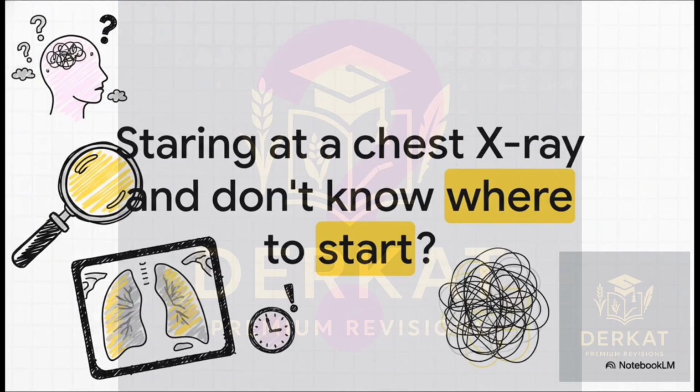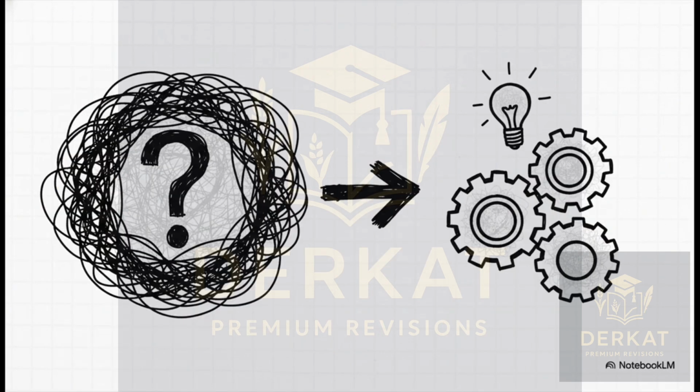Yeah, does this look familiar? That blank stare, the clock ticking down, and you're just wondering, where on earth do I even begin? Trust me, we have all been there. It feels overwhelming because there's just so much going on, and that fear of missing something absolutely critical is very, very real. But here's the secret, okay? You don't need to be some kind of radiology wizard. You just need a system, a reliable, repeatable method that makes sure you check everything every single time. And that is how you go from feeling completely lost to being in total control of the situation.